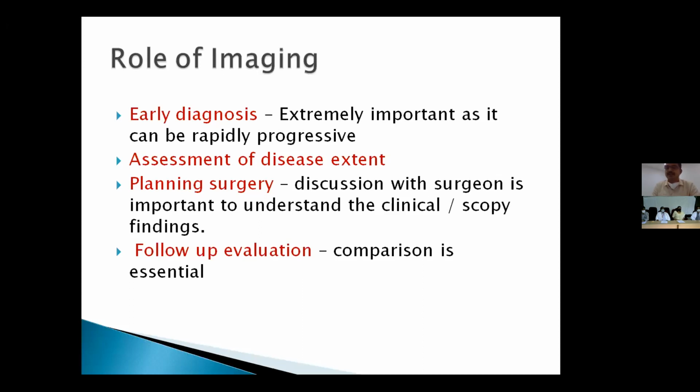Planning the surgery. Discussion with the surgeon is important to understand the clinical and nasal endoscopy findings, thereby helping him with additional imaging findings, which might be helpful for the patient. Follow-up evaluation. Comparison with the prior imaging is essential. So pre and post-operative images can be compared, which might be useful in follow-up.